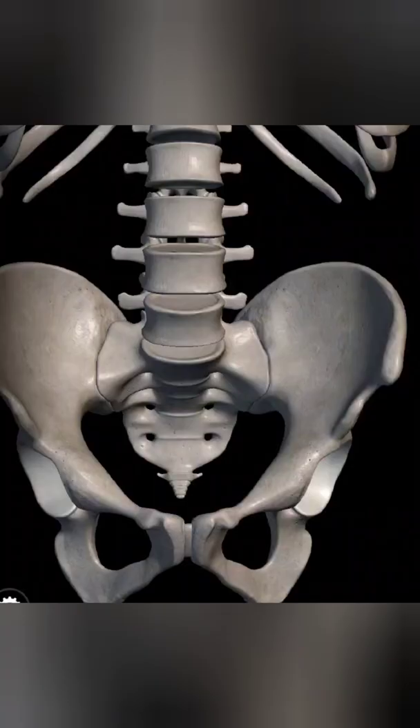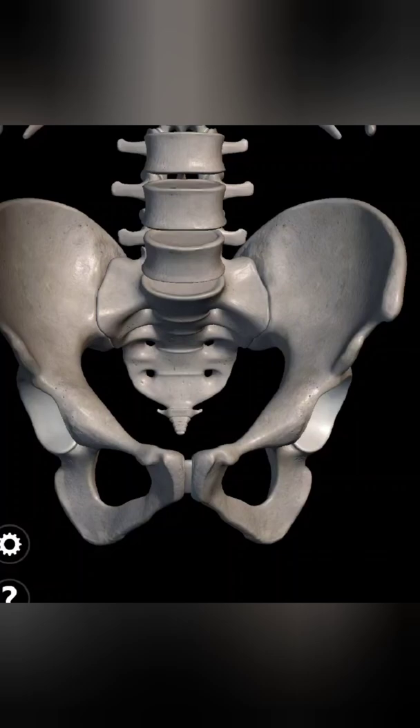Before going to the actual video, I will show a demonstration of bone marrow aspirate from ASIS.